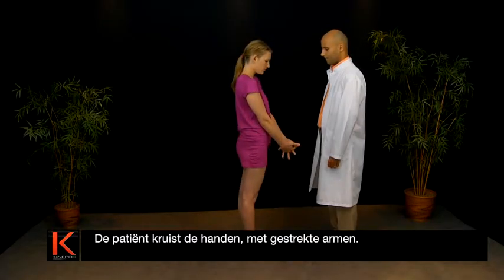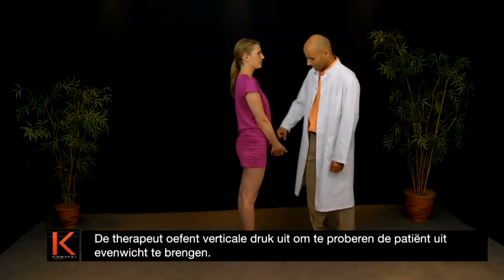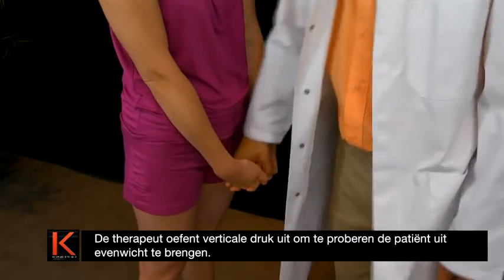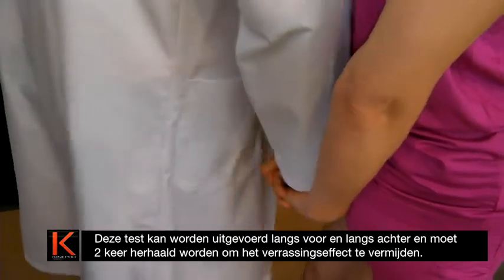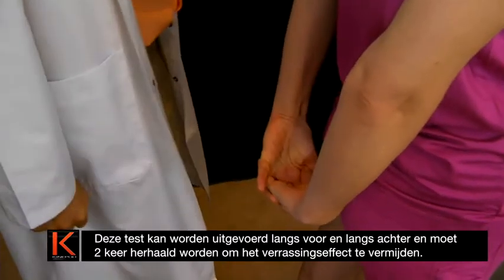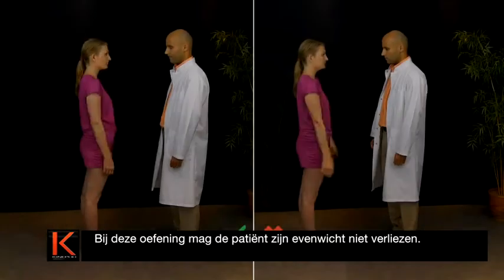With arms outstretched, the patient crosses his hands. The therapist applies vertical pressure to try to unbalance the patient. This test can be carried out from in front or from behind and should be repeated twice to avoid any effect of surprise. In this exercise, the patient should not lose his sense of balance.